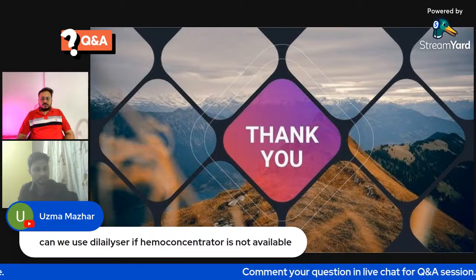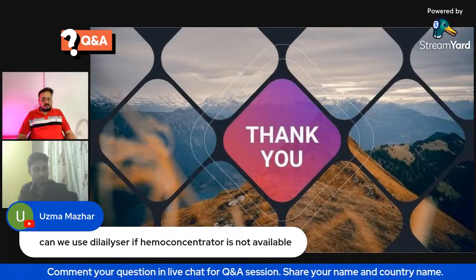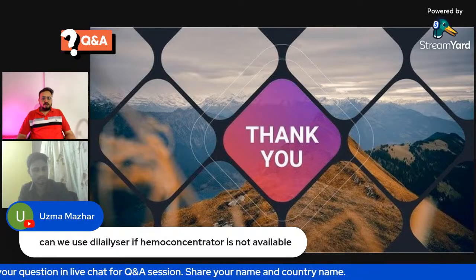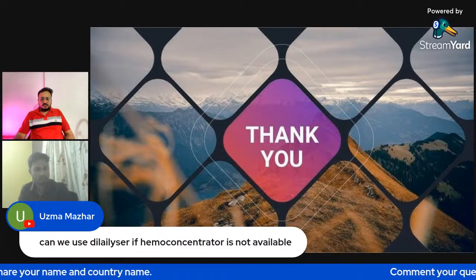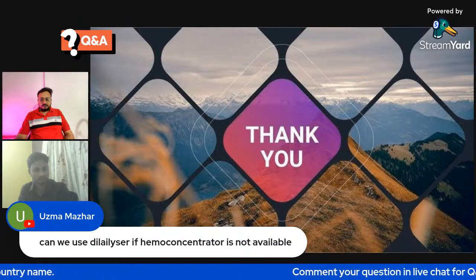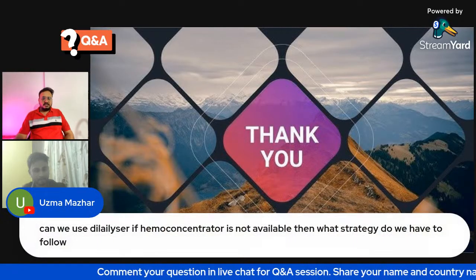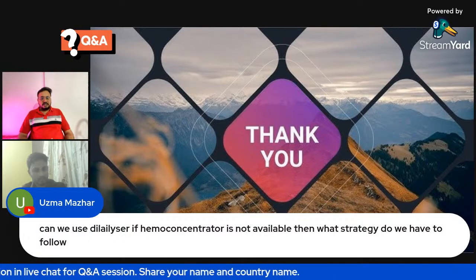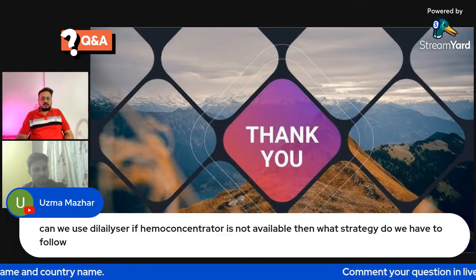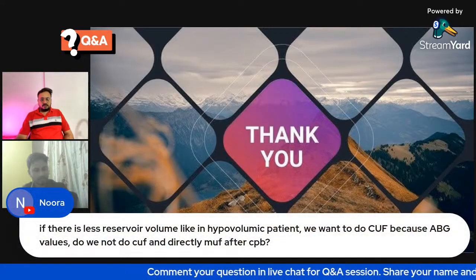Okay, so we have one more question. It's from Uzma Mazhar, and her question is: can we use a dialyzer if a hemoconcentrator is not available? We can use it, sir. Is there any specific strategy for that? No, sir, same circuit only. Same strategy. Any pressure changes? No, sir.